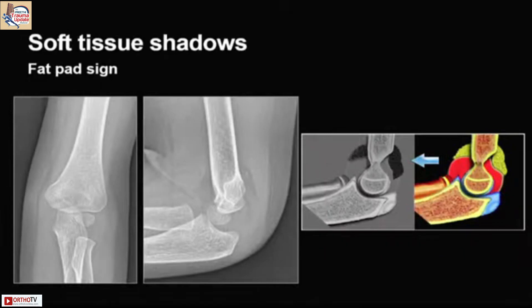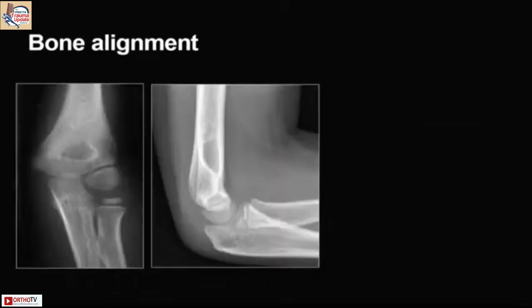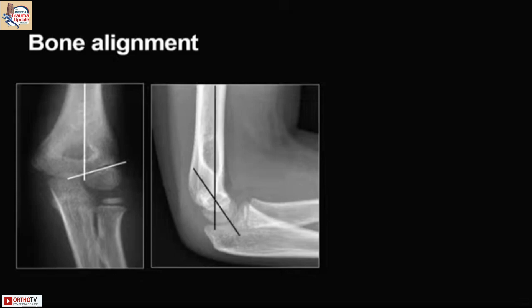Initially we look for soft tissue shadows — where is the swelling, medial, lateral, anterior, or posterior — and we look for something called the fat pad sign or sail sign. You can see the shadows on the lateral view, both anterior and posterior. Then we look for bony alignment: is there good cortical continuity, is the Baumann angle normal (around 72 plus or minus 5 degrees), and how is the shaft-condylar angle (around 40 degrees). The anterior humeral line should cut directly through the central third of the capitulum.